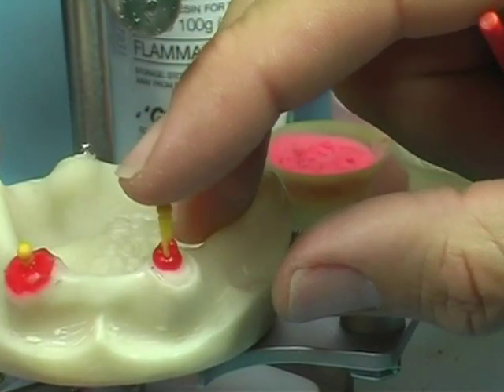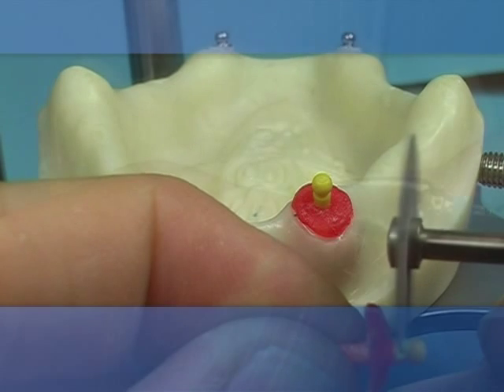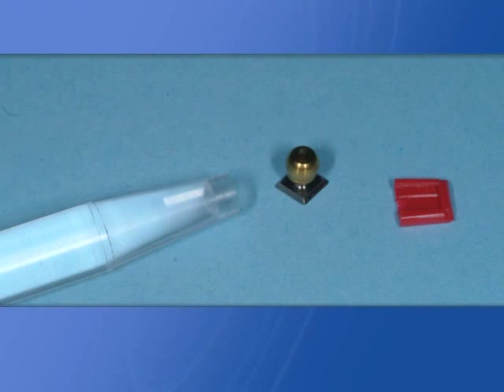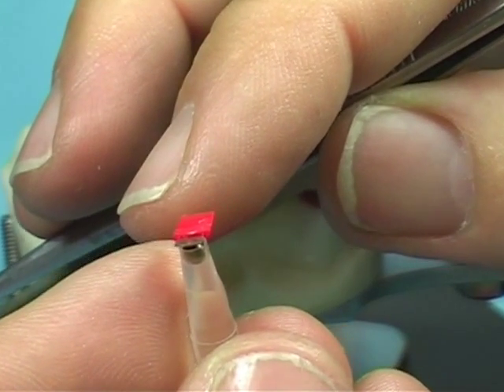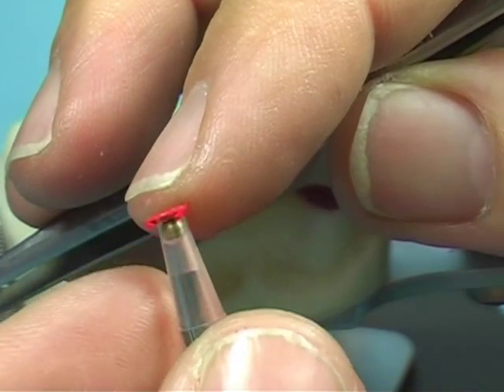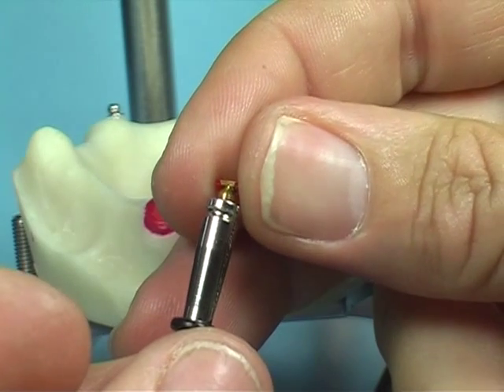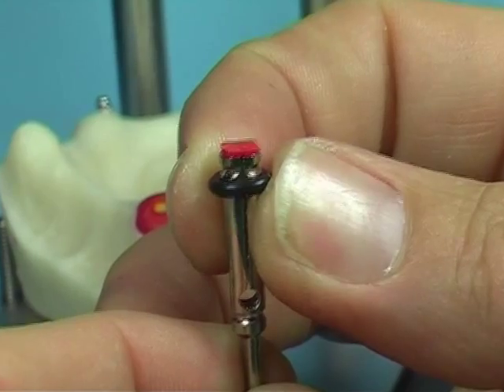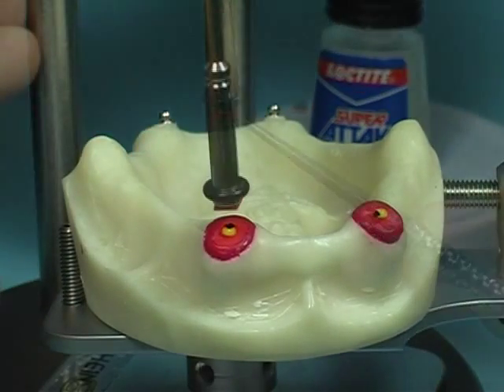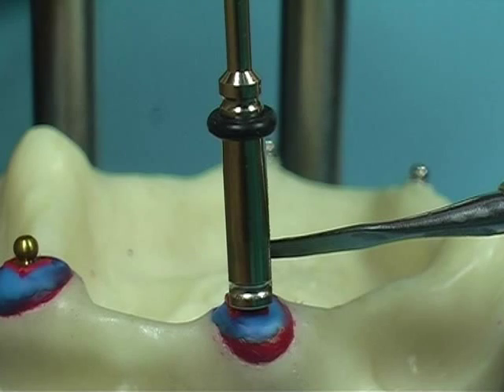Techniques to prepare the root cover are still as previously illustrated and can be adjusted by the technician as desired. Slide the sphere into the castable base and position it in parallel using the parallelometer key. Glue the castable base on the cover to secure it in place.